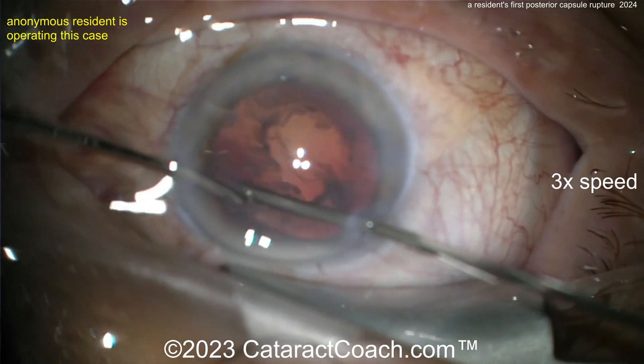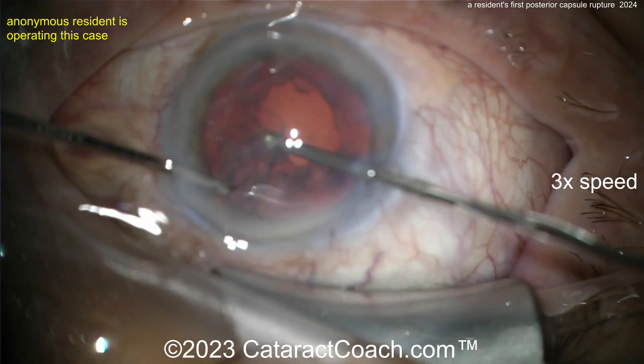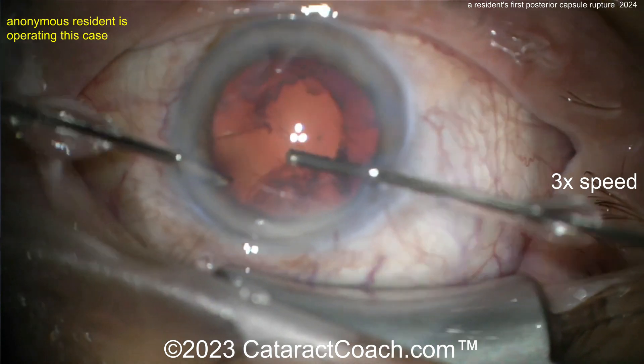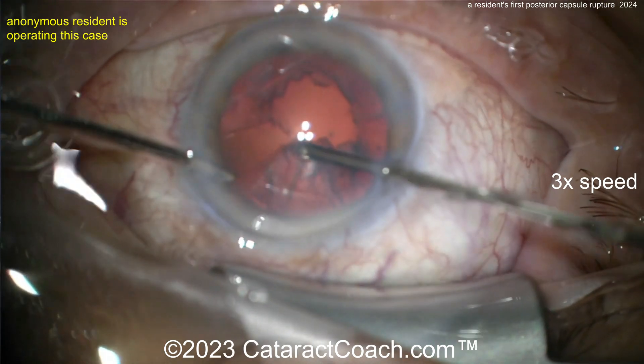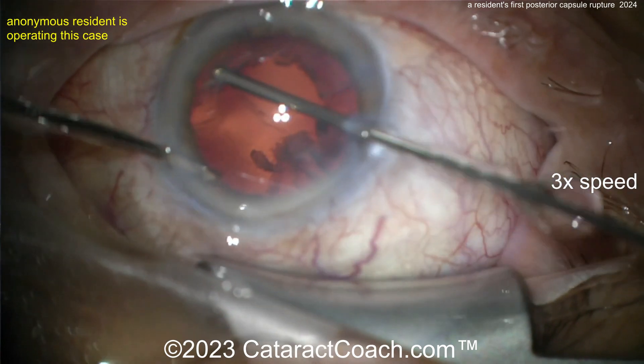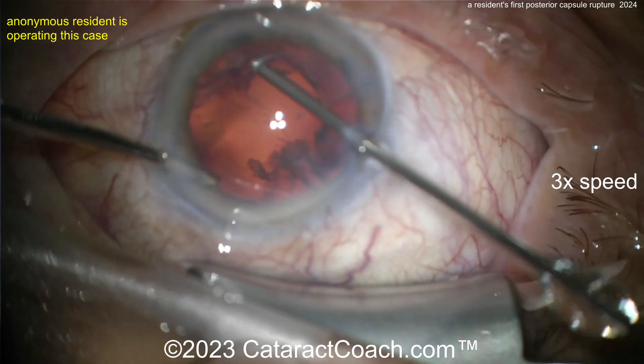If you removed enough of the prolapsed vitreous, you should be able to get the cortex out. Take your time — you can still salvage this case. The rhexis is probably intact, so you can place a three-piece lens with the haptics in the sulcus and optic capture behind the rhexis for a really nice outcome.